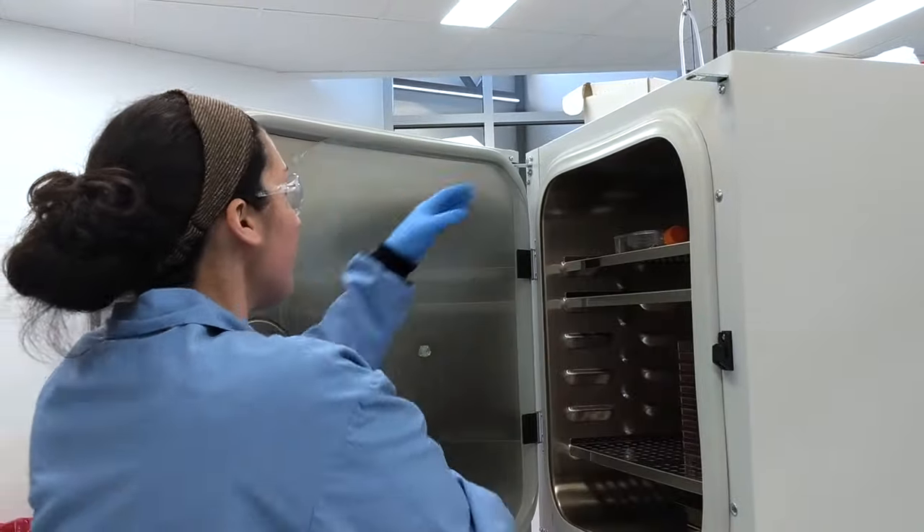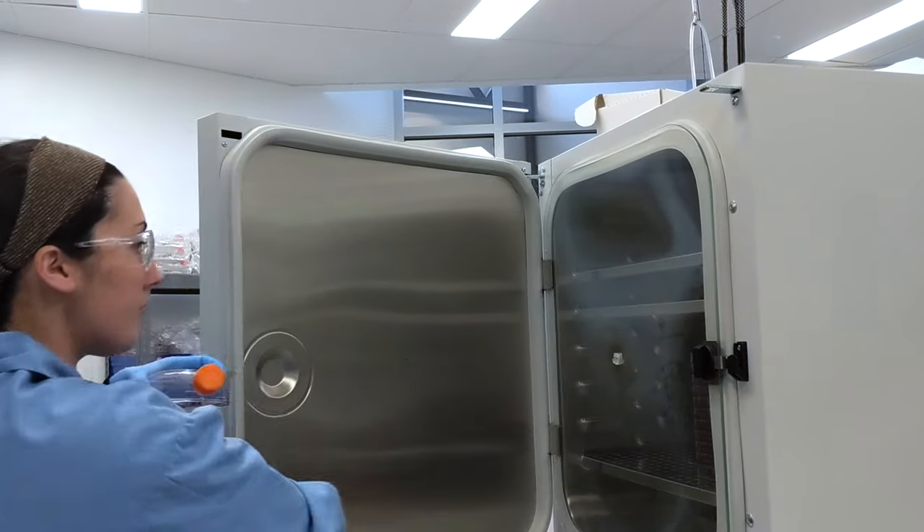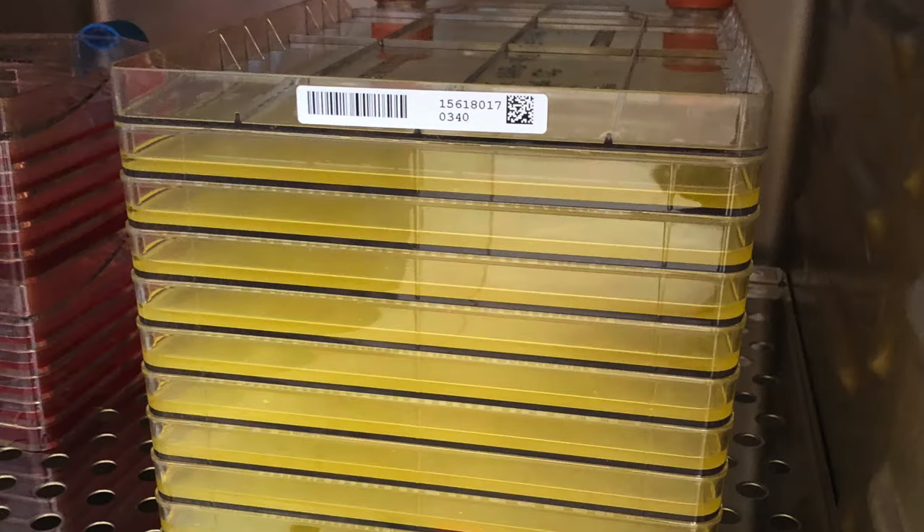Before handling cells, you should examine your cultures both macro and microscopically for signs of contamination, such as bad odors in the incubator or a change in media color. Often, contaminated media will turn yellow due to the acidic byproducts of microbial growth. In addition, media may appear turbid or cloudy.